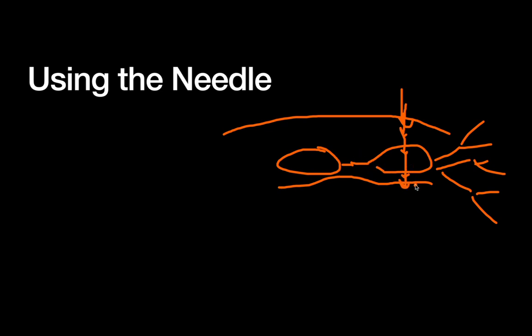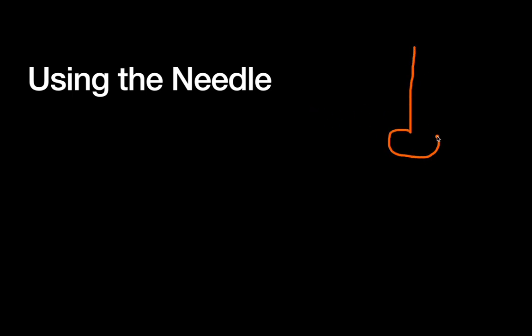Once you hear that third click, you're going to do a gentle wiggle. And you can imagine that if your needle's all the way through, there's nothing holding the tip in place. So the needle's going to wiggle along this axis this way in all these directions. Whereas if your needle tip is stuck in some layer and you go to wiggle it around, you can imagine that that tip's going to stay relatively fixed in place. It's not going to easily move around that axis. If you've heard your three clicks, you feel like it's kind of wiggling appropriately, then you do what's called the aspiration and drop test. And that's when you attach a syringe to the end of your Veress needle. And you're going to first aspirate. And so you draw back. And that's a way of checking to see if you're in an organ, for example, the bowel or the stomach, or if you're in a major vascular structure.